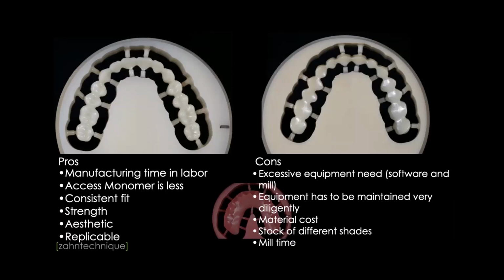Why do we need that actually? Well, the sense of having a printed base sometimes is, I have a 30 or 35 millimeter blank thickness, and my palate maybe is super deep. I have these extreme cases, and in dental technique we always have these extreme cases, where I maybe need a 40 millimeter blank. I don't have that. So I can say, all right, I have to print that specific case, but I still can mill the teeth if I want to.